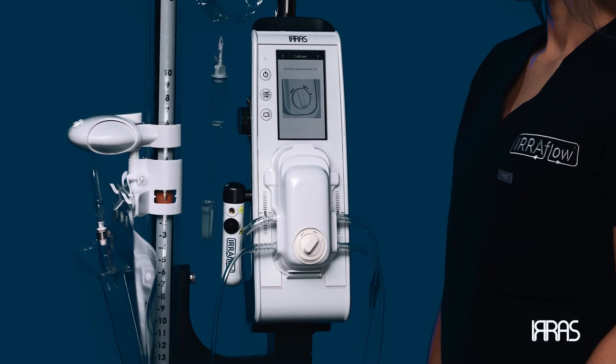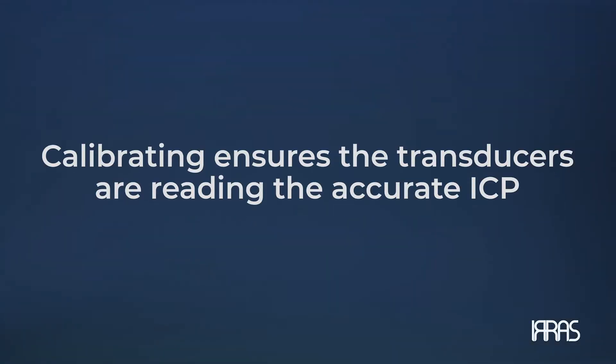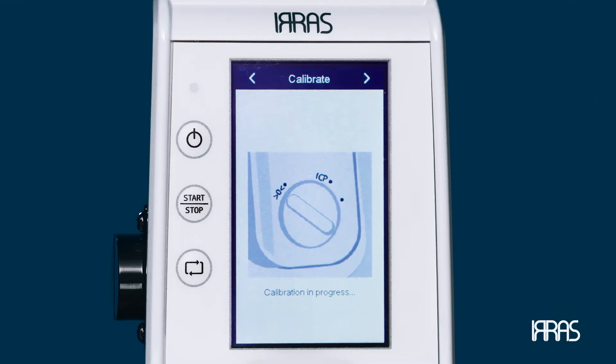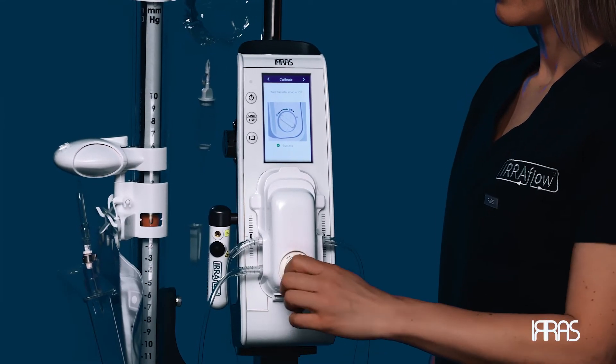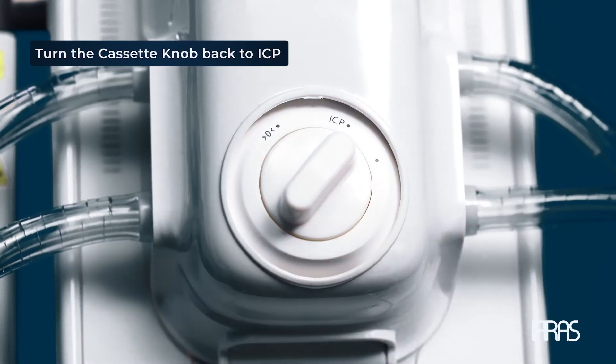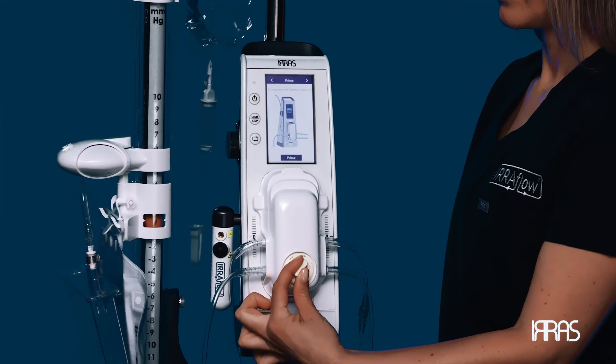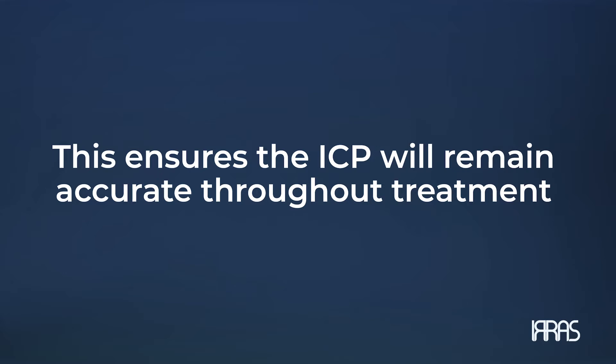Calibrating. It is now time to calibrate the cassette. Calibrating ensures the transducers are reading accurate ICP and accounts for atmospheric pressure in the room. Turn the cassette knob to the zero position, delineated by the zero icon, and wait for the control unit to calibrate. When calibration is complete, the screen will confirm calibration success. Then turn the cassette knob back to the starting position labeled ICP, turning it all the way clockwise until it will not turn anymore. You will be prompted to do this every 24 hours to ensure ICP remains accurate throughout treatment.